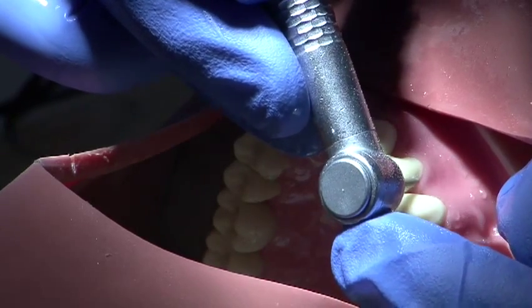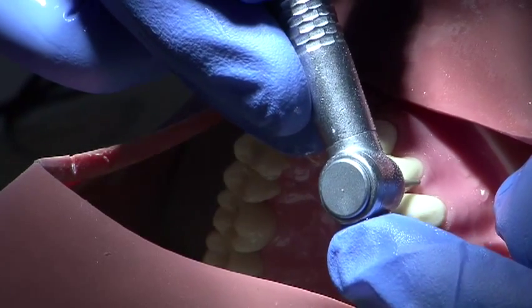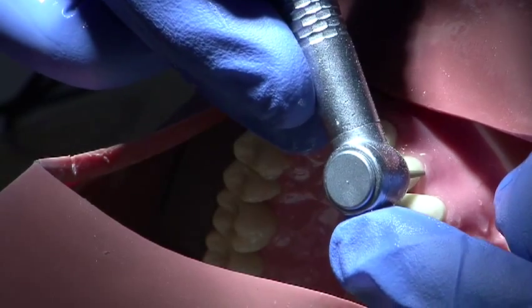Following this, the margins are refined using a fine burr to ensure that they are smooth throughout.